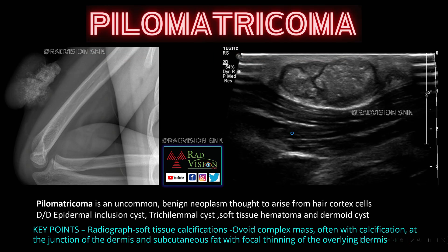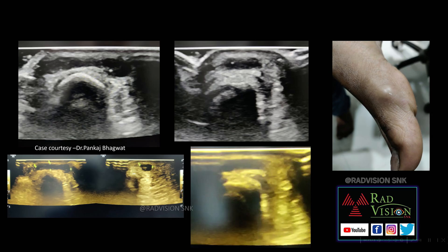Here you can see diffuse soft tissue calcification on radiograph, and an ovoid complex mass showing calcification at the junction of the dermis and subcutaneous fat with focal thinning of the overlying dermis — this is a classical case of pilomatricoma. Whenever you see extensive dense soft tissue calcifications along with ovoid complex masses with classical calcifications, suspect pilomatricoma.